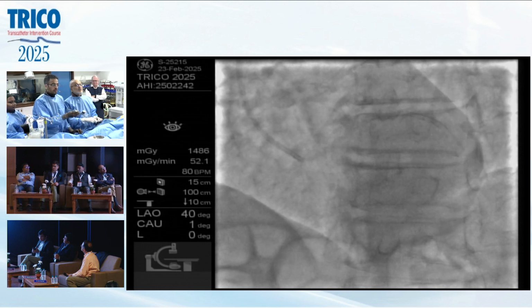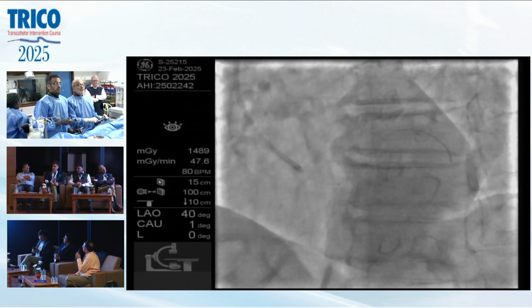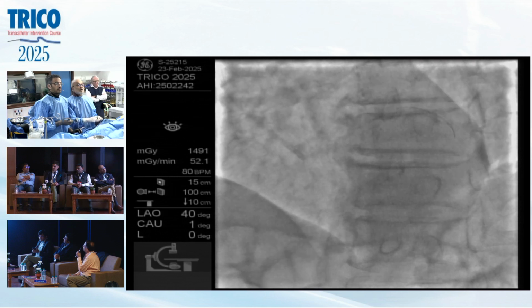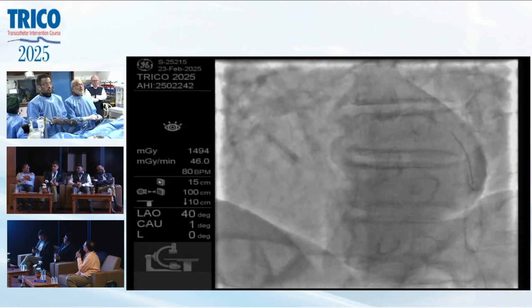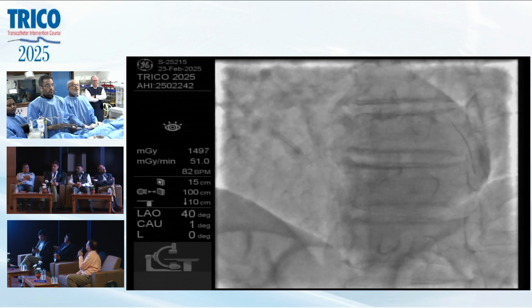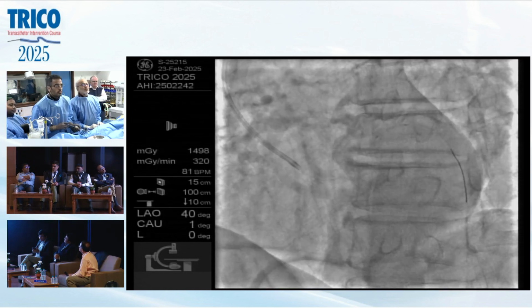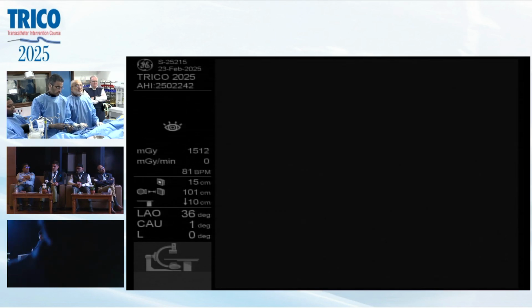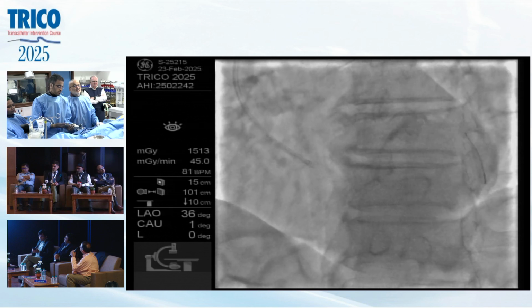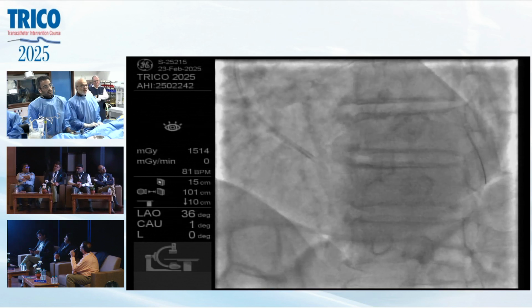Okay. Balloon? It's just at the proximal part of the stent. Yeah, I would go a little bit, one more balloon length further, right? At the top of the hill, so to say. Okay. Yes. That looks good. Injected. Go up. We can see it. You can even see the stent diameter is a little bit less there, so it'll look good. 15. Now we are pushing the struts into the media. Deflate.